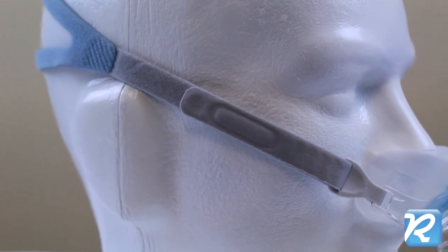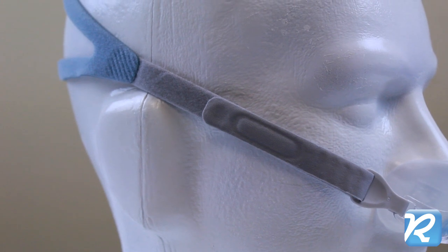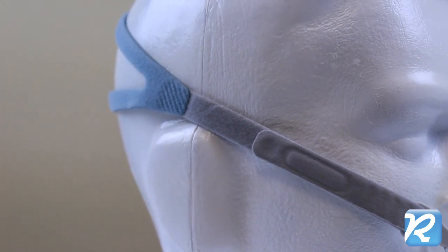Winged side supports give the pillows additional stability. The minimalist headgear is firm across the cheeks, but stretchy at the split back strap.